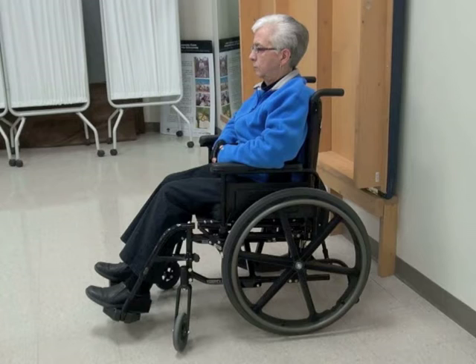Being able to position your body effectively in the wheelchair can have a very big impact on your ability to perform wheelchair skills. Leaning forward, backward, and sideways at the right time can make the wheelchair easier to push or maneuver, lower the risk of tipping or falling out of the wheelchair, and improve your ability to reach for objects safely. In the next section, we will review how you can change your posture while using the wheelchair and situations where this may be helpful.